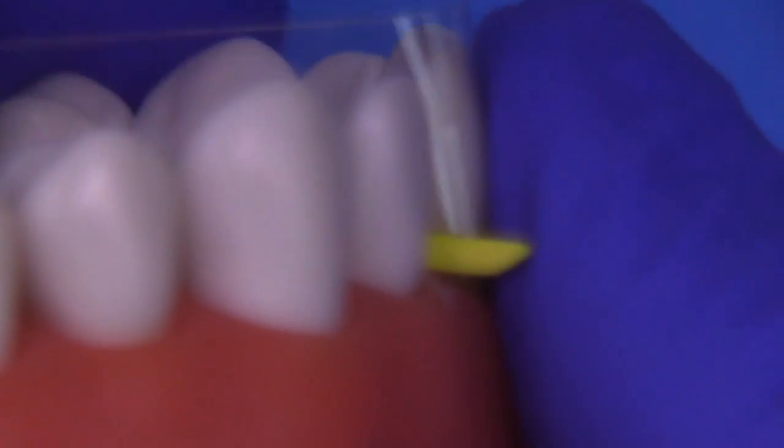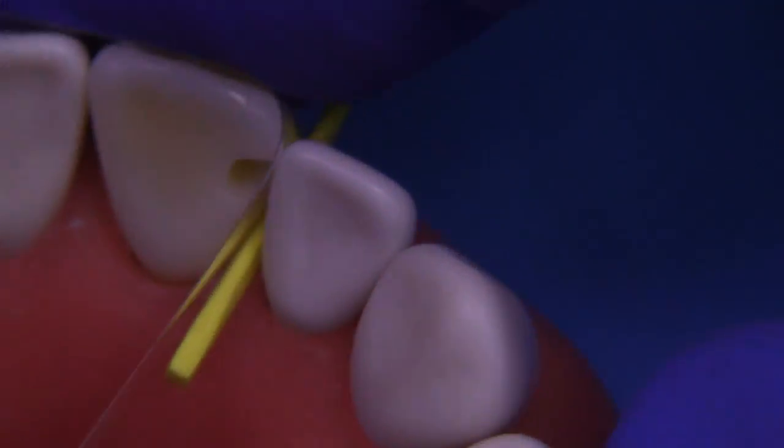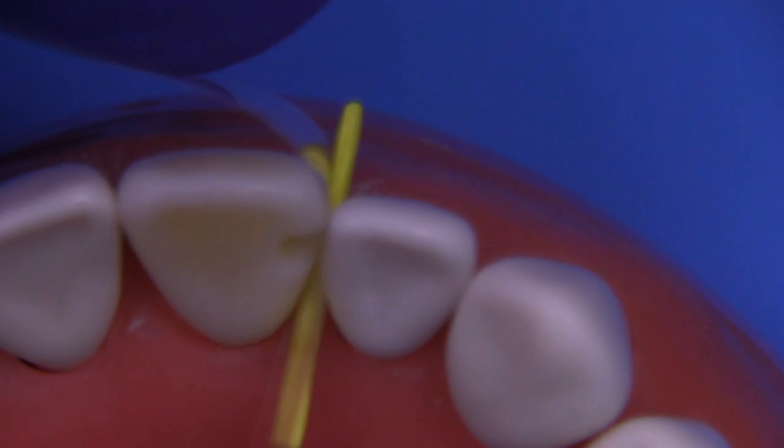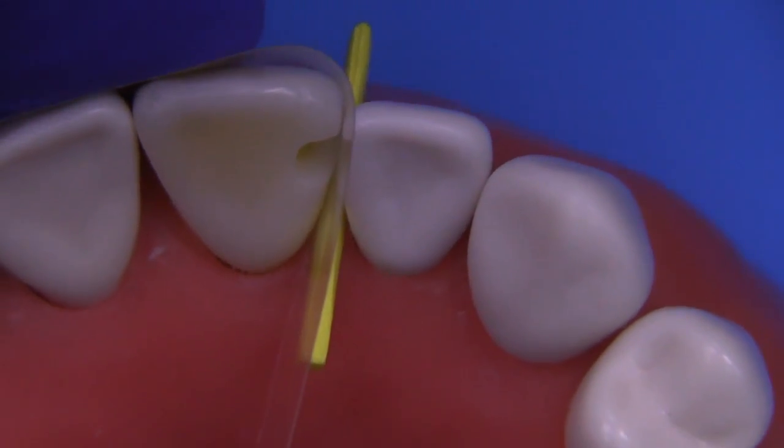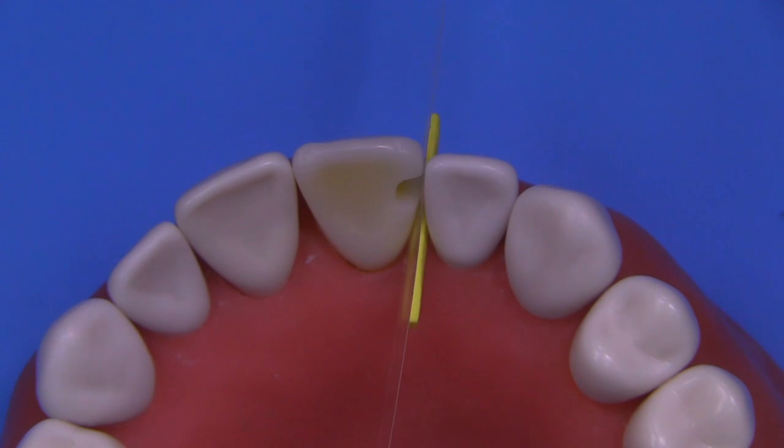It should be secure and it shouldn't pull out easily. In other words, the wedge has to trap the band against the tooth. We're going to be wrapping the plastic mylar matrix strip across the facial and then across the lingual to establish the bulk of the contours.